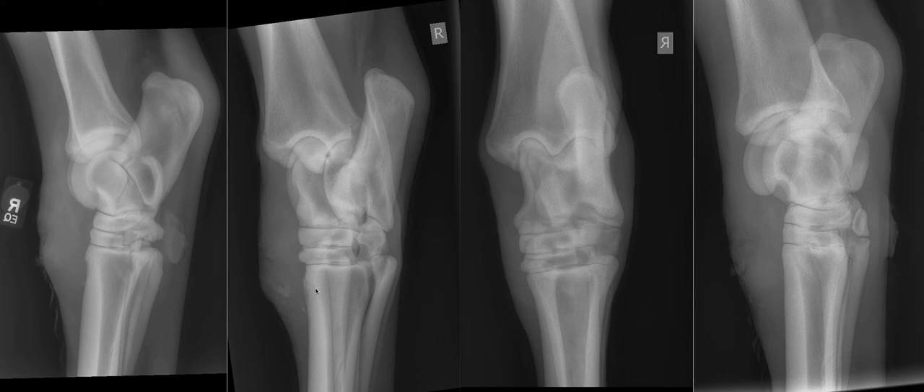This defect in the bone is called an involucrum. The sequestrum is the little bit of bone, and the involucrum is the area it sits in. Usually they're a similar size to the sequestrum, but sometimes you can get them a little bit bigger, like this one.